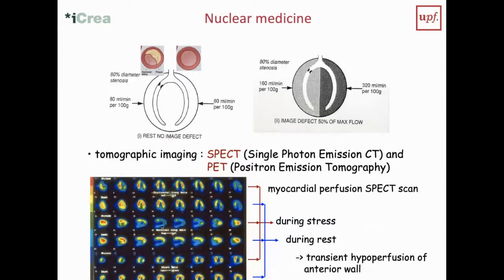When we look at the heart, what used to be the case, and still is being used a little bit, but less and less, is, for example, perfusion imaging. So we use a tracer that can measure how much blood flow is going to different types of tissue. And so we can measure perfusion defects that are induced by a stenosis, for example, of the coronary artery. And very often we can do this with a kind of stress test. It's mainly an adenosine stress test.